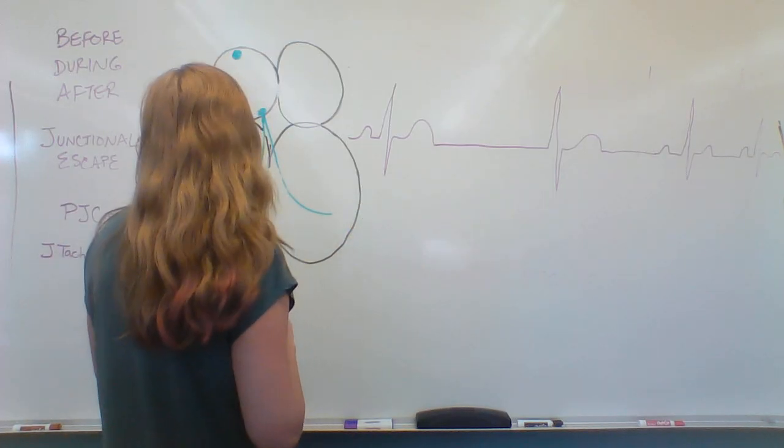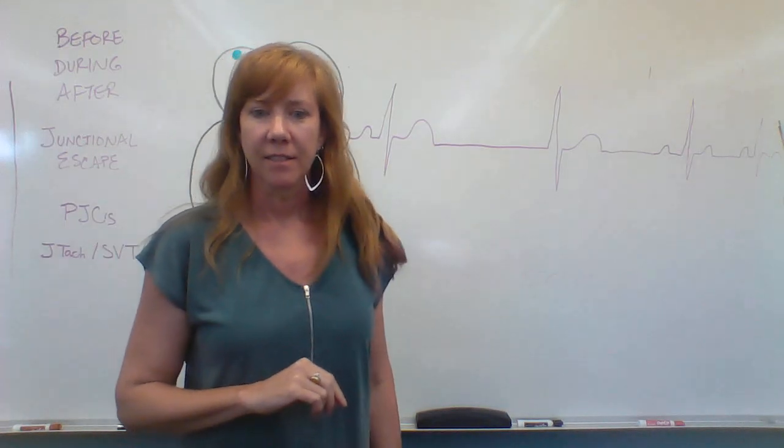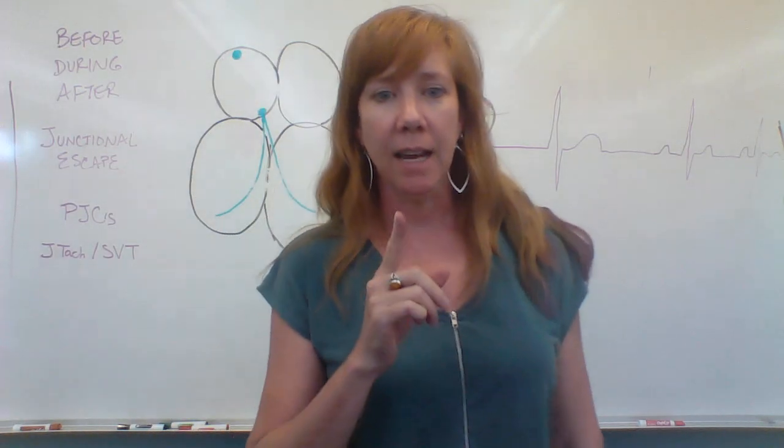All right. That's it for junctional. Next, heart blocks.